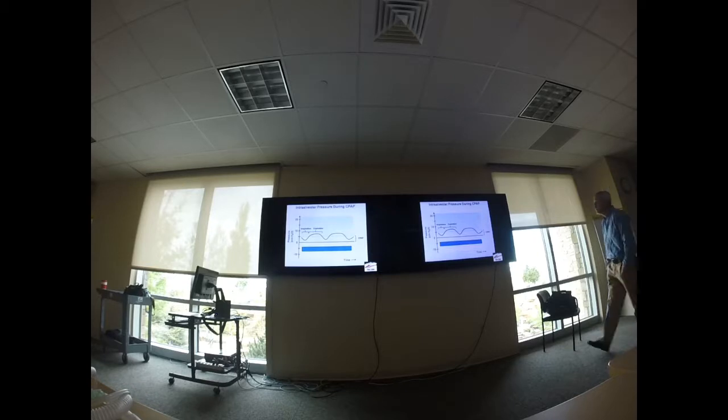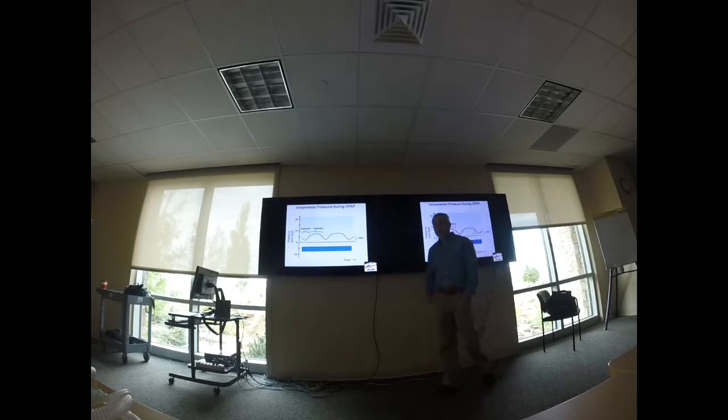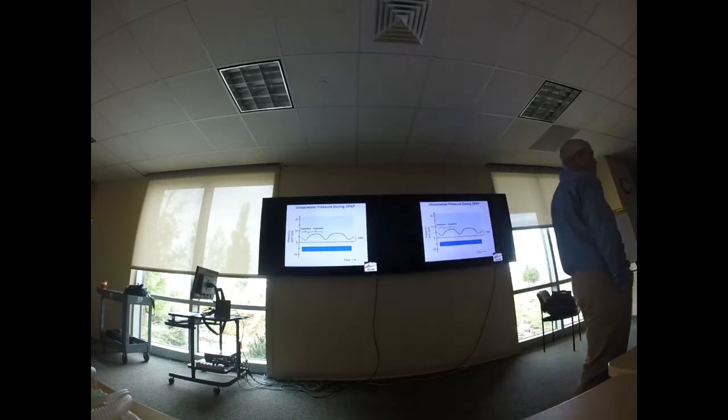You can see that it's the dashed line right there. So it's going to deliver the same amount of pressure throughout the ventilatory cycle. Other than that, it doesn't change the aspects of ventilation. That's all it does, just delivers pressure throughout ventilation.